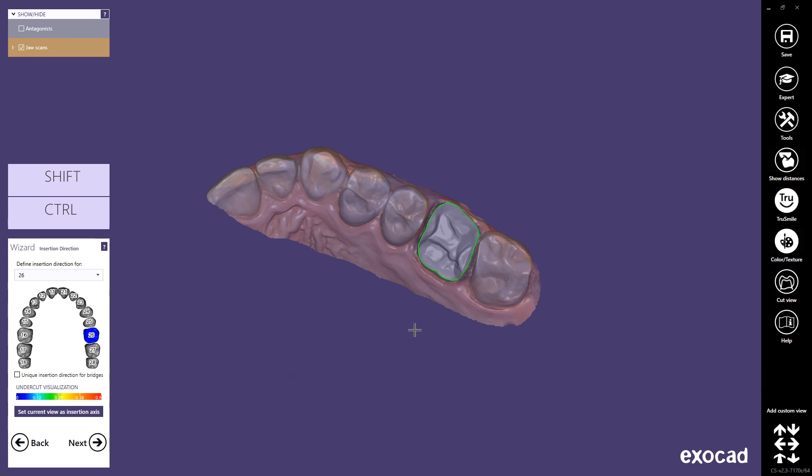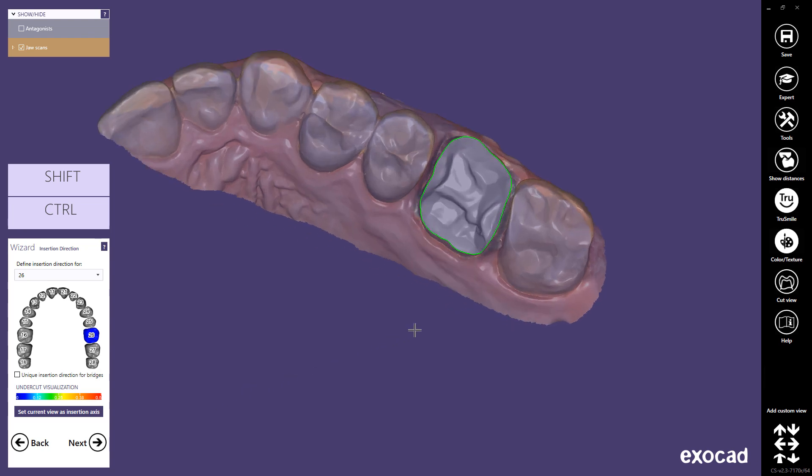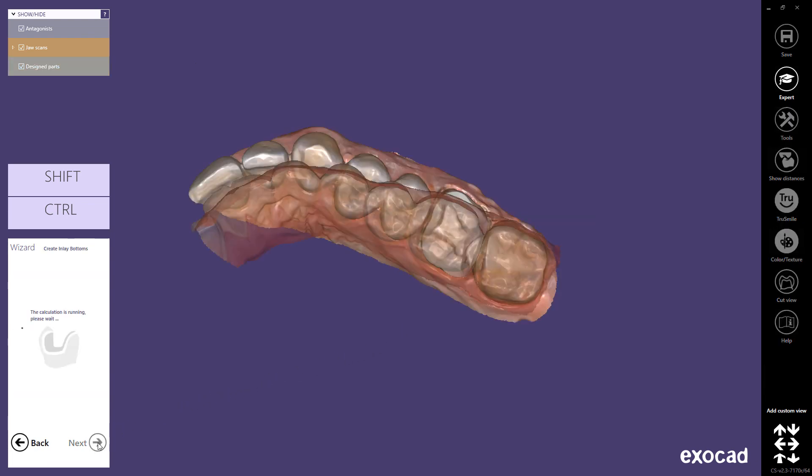In this step, we are prompted by the wizard to verify the insertion direction. Chairside CAD shows the automatically detected insertion axis by adjusting the viewpoint so that you look onto the preparation in the direction of insertion. In case you need to adjust the path of insertion, rotate the view so that you look onto the preparation in your desired insertion direction, and then click Set Current View as Insertion Axis. Click the Next button to proceed.